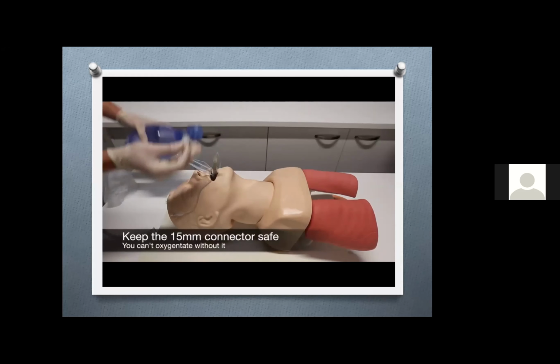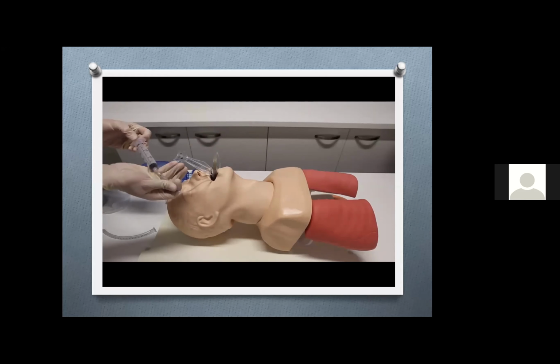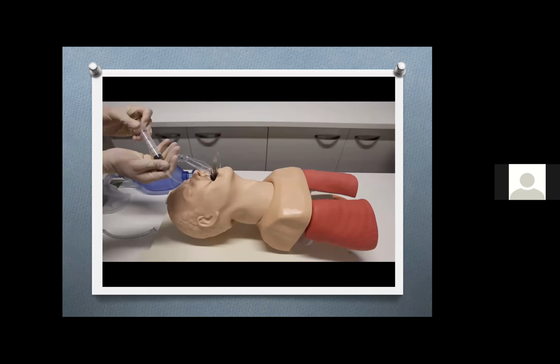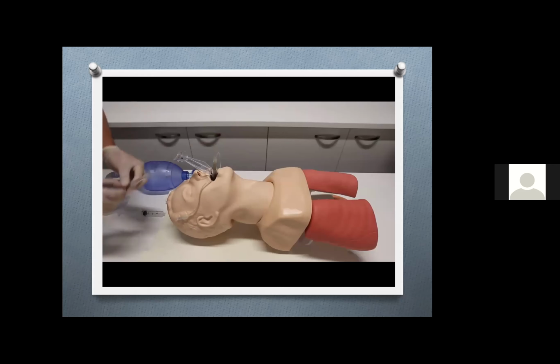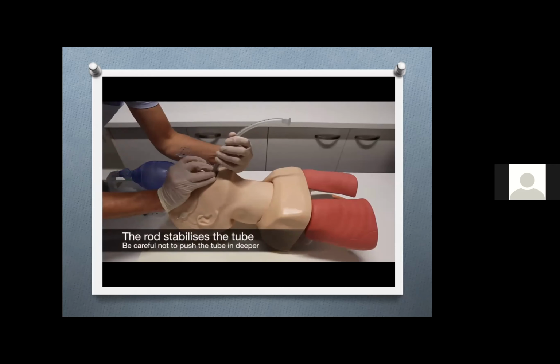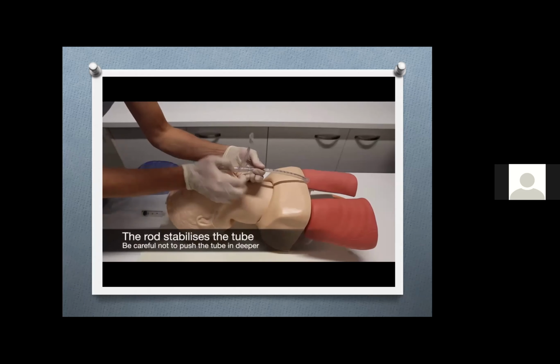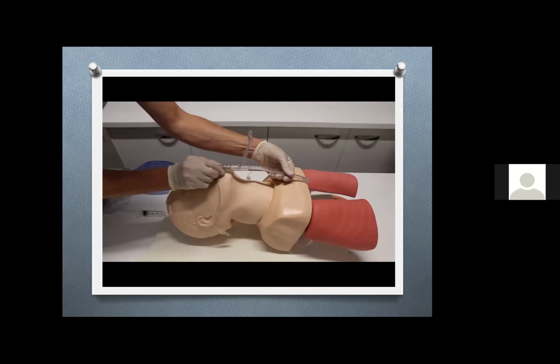Okay, now see how he removed the LMA. He takes out the adapter and deflates the LMA. He kept the tube inflated, so he deflated only the cuff of the LMA. Now he uses the tube exchanger on the tip of the tube, then pushes out the LMA. You don't need to push the tube or the exchanger, just slide the LMA out.